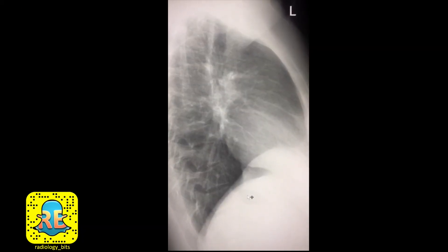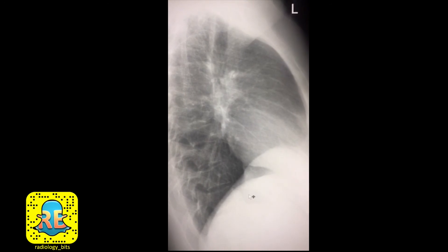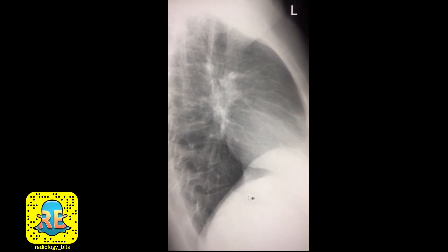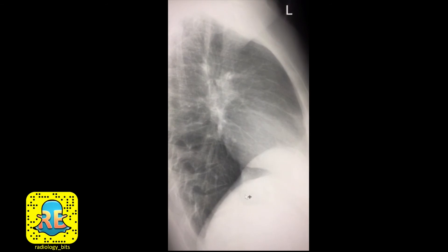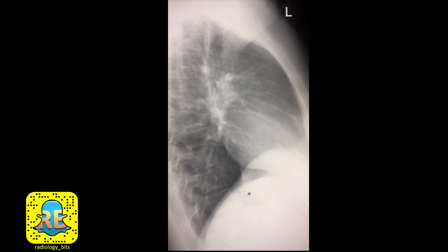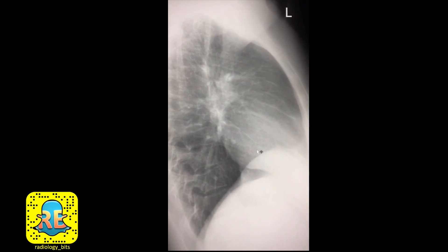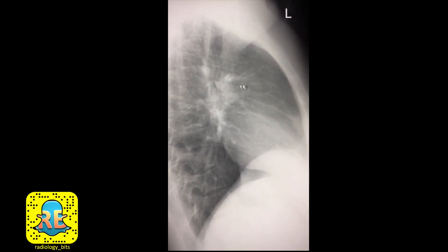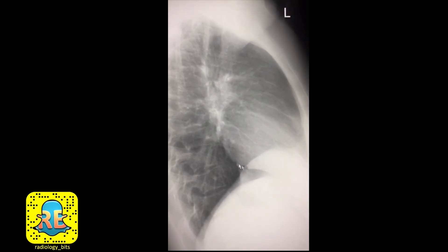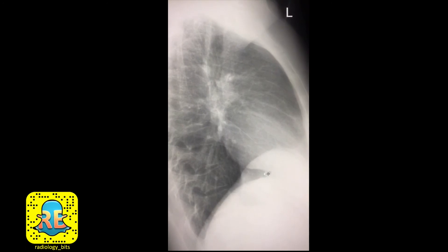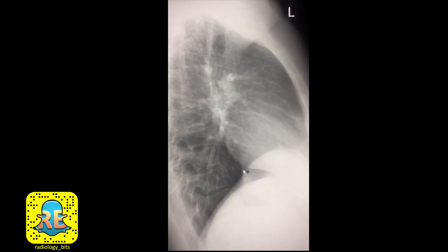Hi again. This is a quick show-and-tell case basically for juniors. Seniors, you probably know this, but stick around if it's the first time you hear about it. This is a lateral chest radiograph — this is anterior where you have the sternum, this is posterior where you have the spine, this is the cardiac opacity. My question is: what do you think this opacity is here, where you see that line?